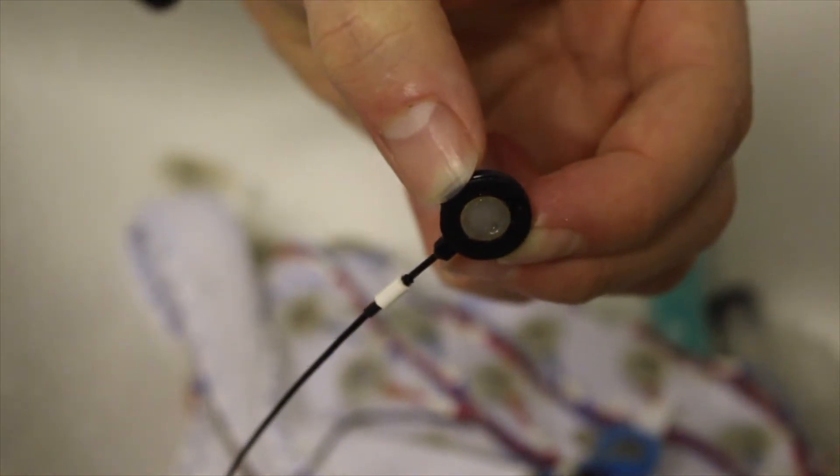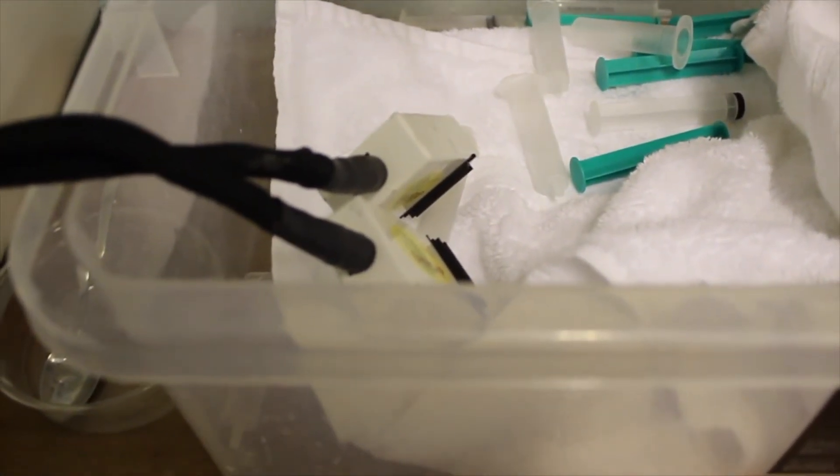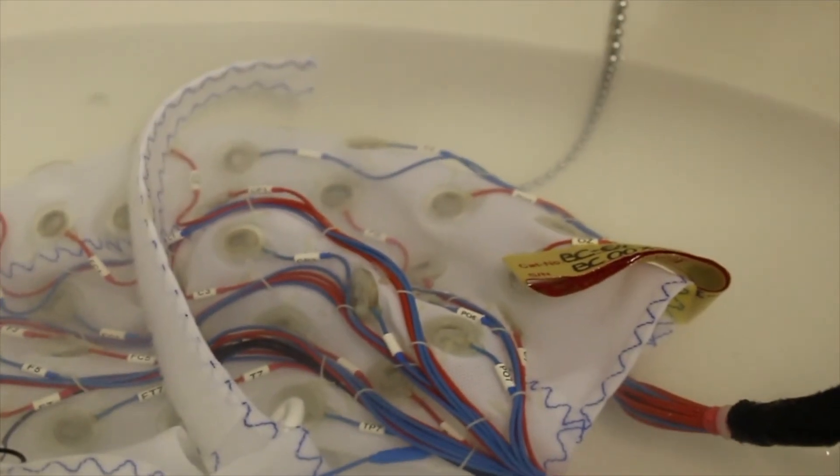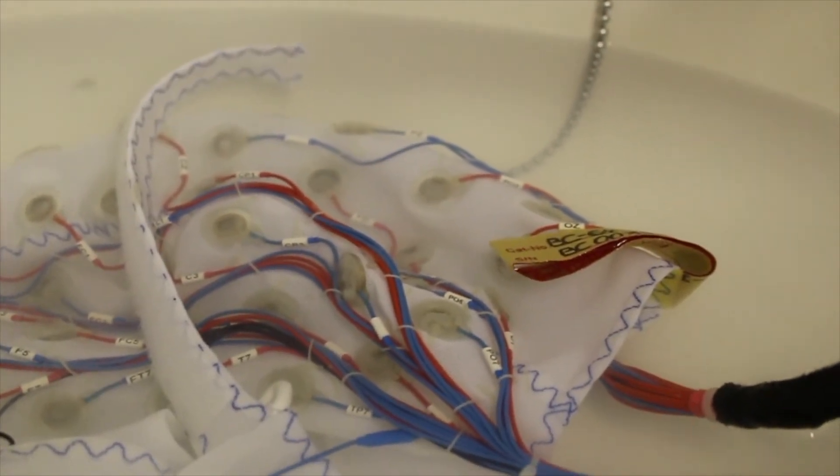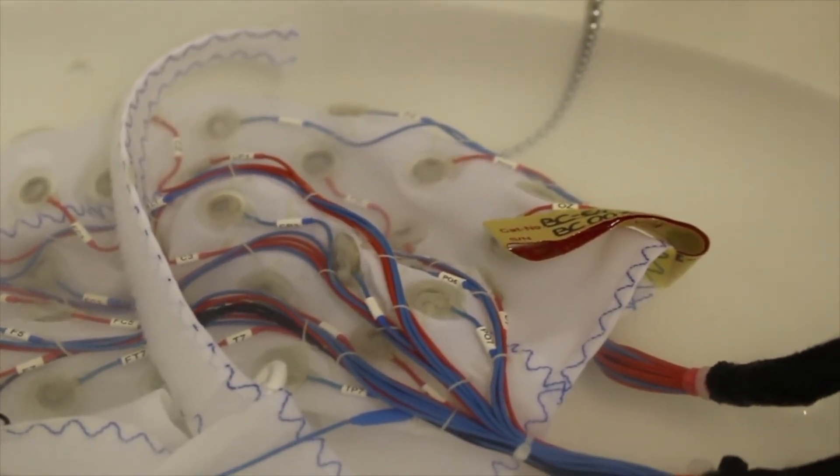Place the cap in the sink, keeping the cords well out of the way of any water. These must not get wet. Fill the sink with lukewarm water and leave the cap to soak for a few minutes. This will make the gel much easier to remove.